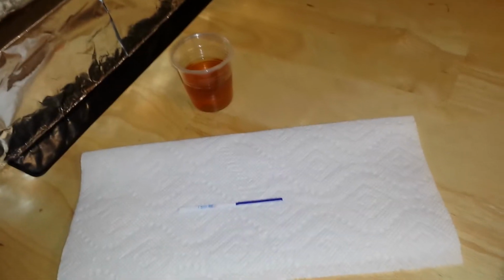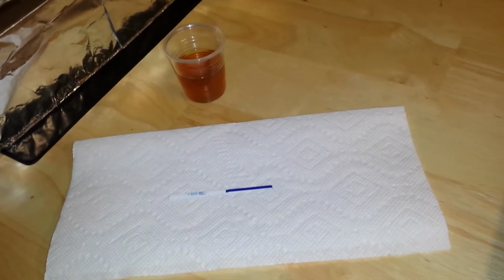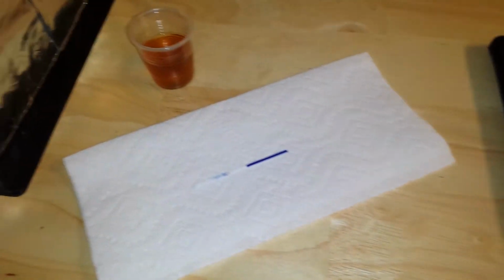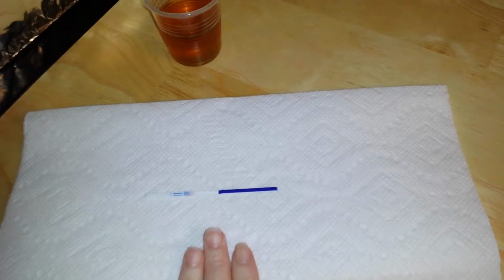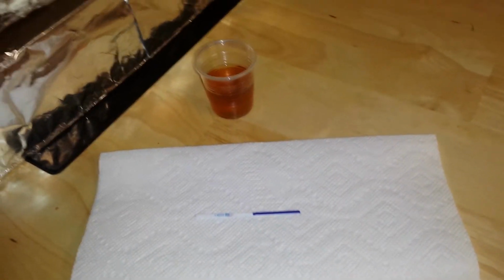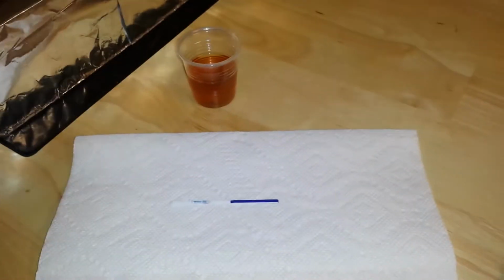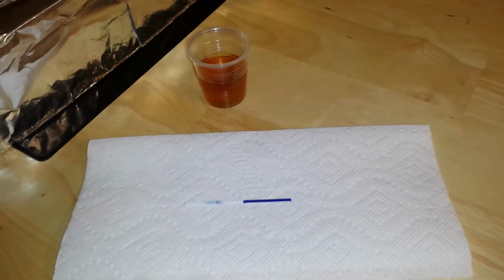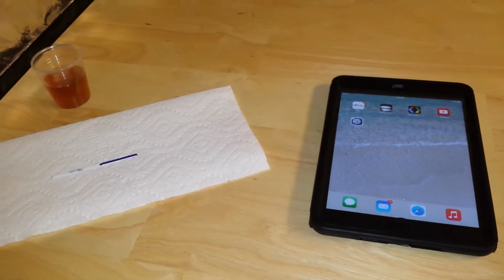Okay, let me go over the true definition of what an evaporation line is. An evaporation line kind of speaks for itself, and I actually have an article on this called The Truth About Evaporation Lines, which goes over so many different lines that you might see on a test and whether or not they are considered a true positive, which most are not. A true evaporation line only occurs on a test that is dry, as the urine evaporates off the test, and sometimes it can make the antibody strip appear a bit more visible. Most of the time they're colorless or grayish looking. Not to say that they can't have color, because I've had quite a few tests that have had pink evaporation lines.